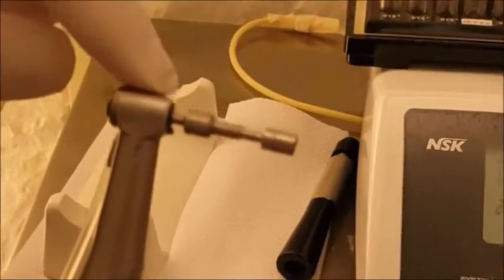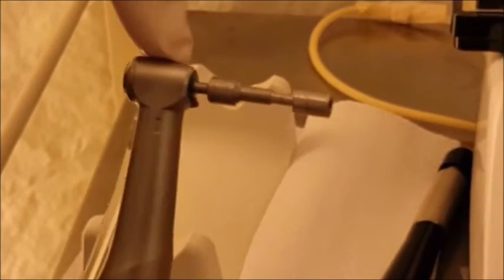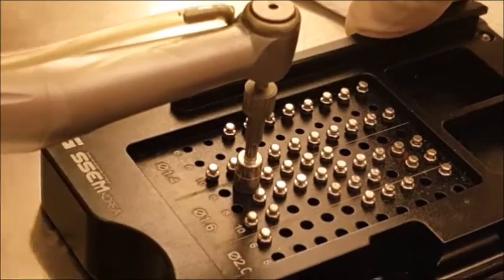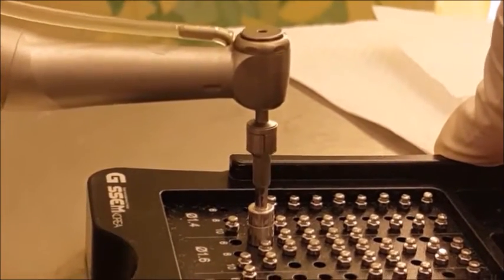Have a look at the contra angle - we have an extension arm as well as the contra angle adapter. The reason for this is that without the extra extension, the head will obstruct the dentition before the pin is inserted. When picking up the micro implant from the kit and holder, make sure the shaft is at 90 degrees to the base of the container, and rotate it left to right until the micro implant is held within the holder, then lift.